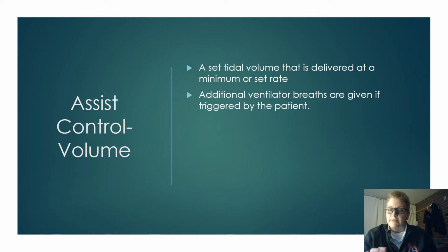Now the assist part is if the patient triggers a breath themselves, then the ventilator is going to assist that and give them that same tidal volume. So additional ventilator breaths are given if the patient triggers that breath.